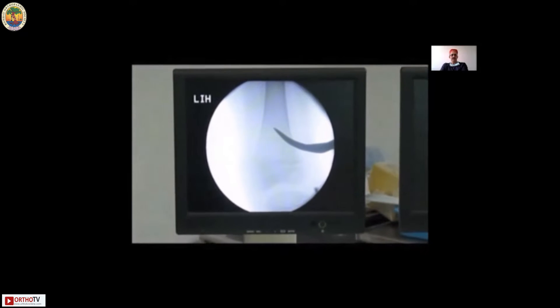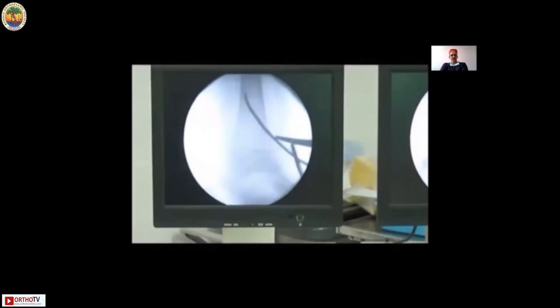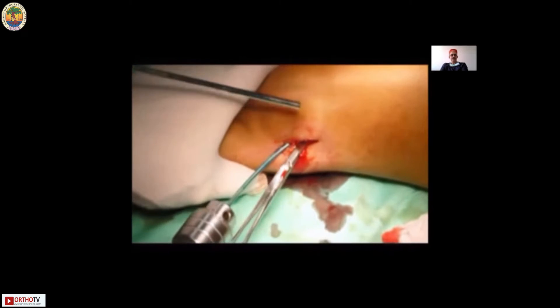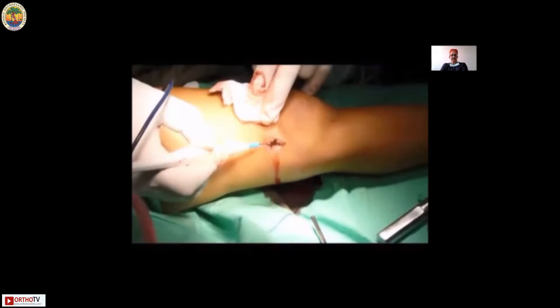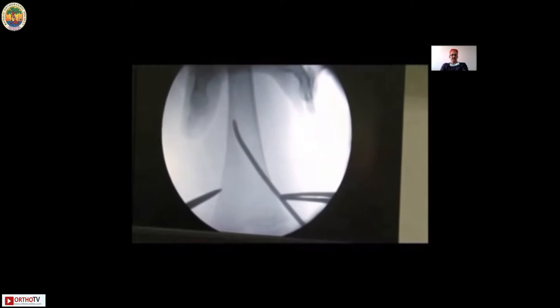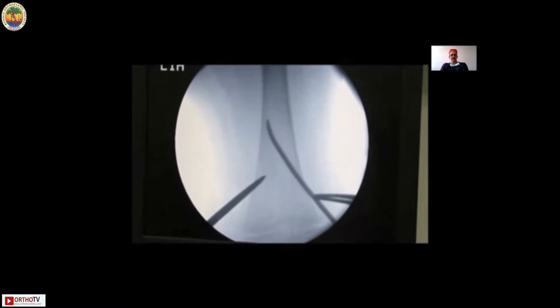Make your entry into the canal initially with a drill or a straight awl, and then use a curved awl so that you enter the canal in the correct direction — such that the first nail goes in from the lateral side and bounces off the medial cortex. Advance the nail with gentle rotational rocking movements to reach the fracture site. The medial incision is again sub-vastus; make sure that your entry is slightly posterior to the suprapatellar synovial fold so that no irritation happens.